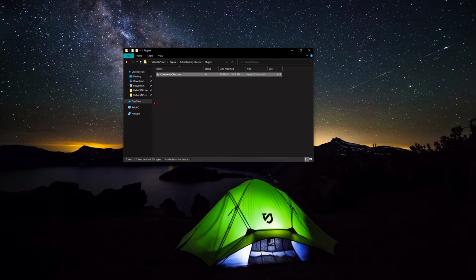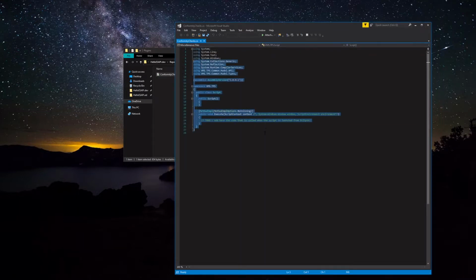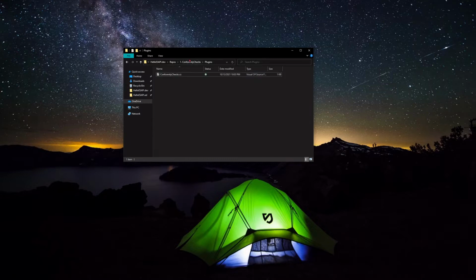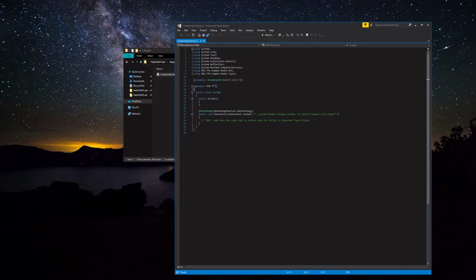Okay, so this is the same exact script, which I don't know why it keeps launching in 2017, but it did. So this is that same exact script, but again, it's just a single file, and it has to be run within Eclipse. I'll open it again just so you can see. What Eclipse does is it looks for this namespace when you run the script inside of Eclipse, or inside of a plan. Then it looks for a class called script, and inside script it looks for this execute method, and then it runs whatever you put. So you put all of your code in here. They added this comment that says to do, add your code here.